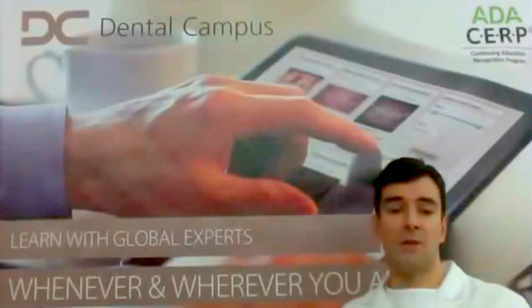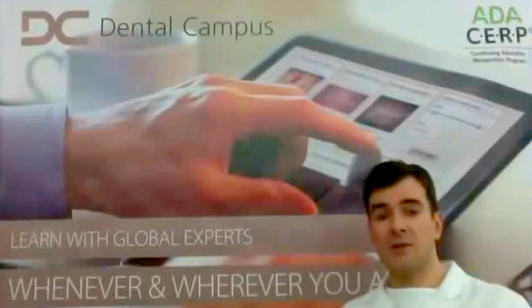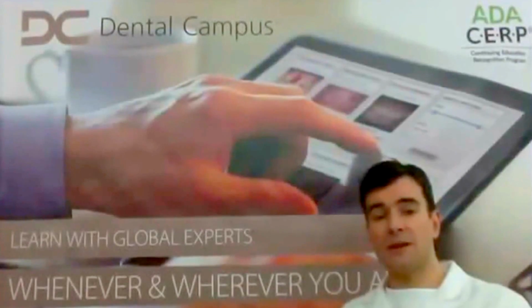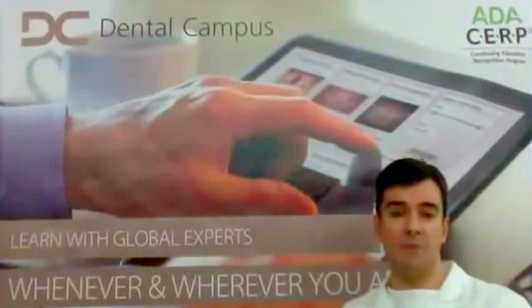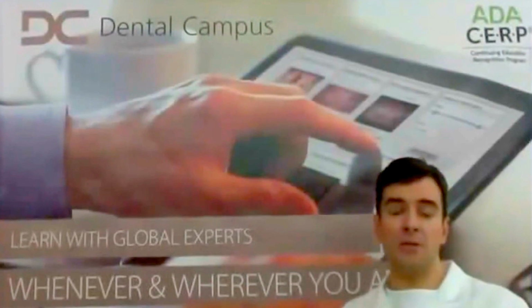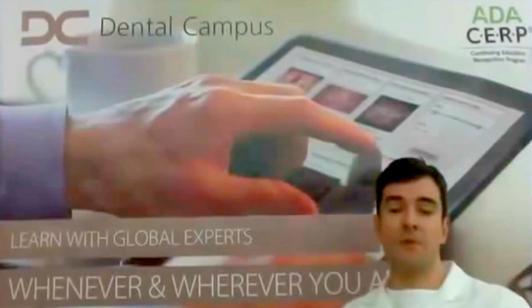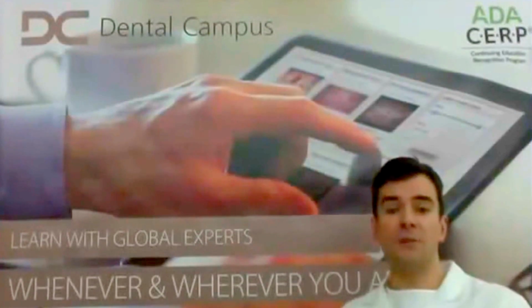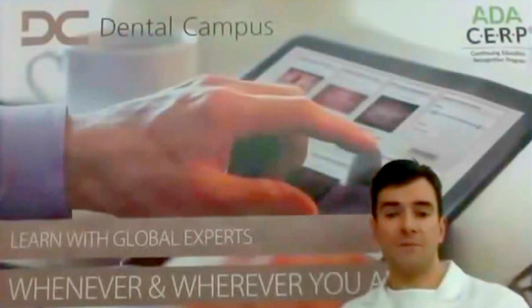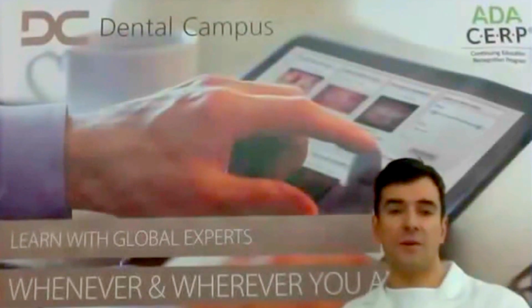You can use regular impressions and then section the model exactly in the middle of the gap in which you plan to place the implant. By adding this information on the thickness of the soft tissue, it's possible to map the three-dimensional size of the bone ridge.